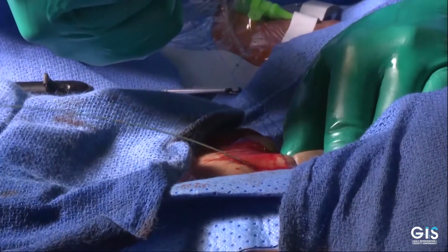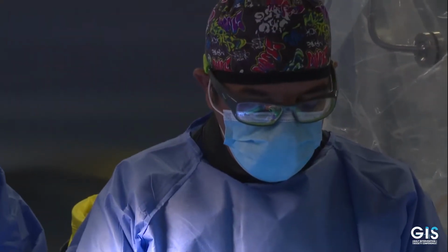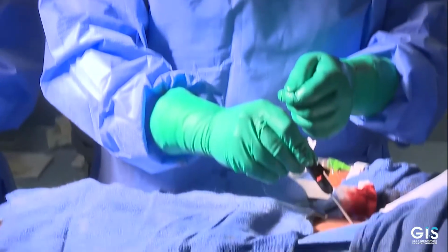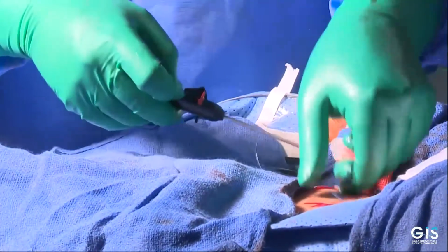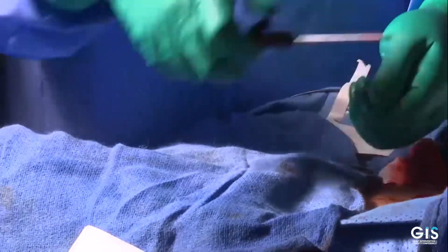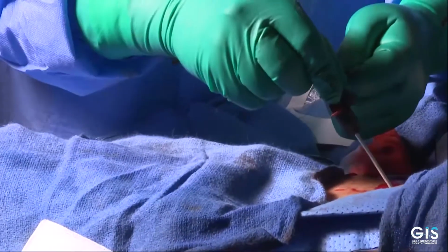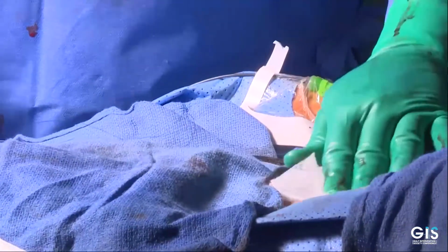There is a bleed. I just put some more tension. Okay, I want you to take the wire on my count. Okay, go ahead, take the wire. Okay, so deployed it further, and now we're going to lock and advance it and carry it down to the skin level, and we just apply pressure, please.